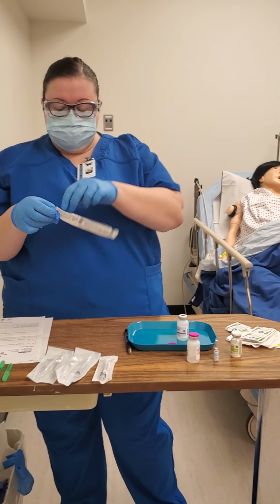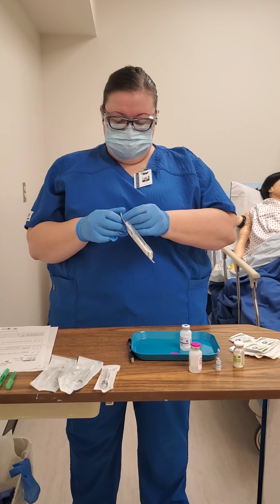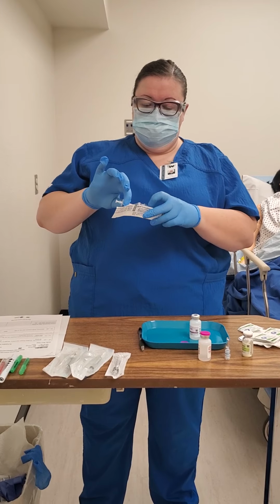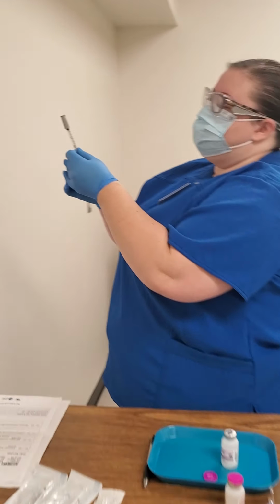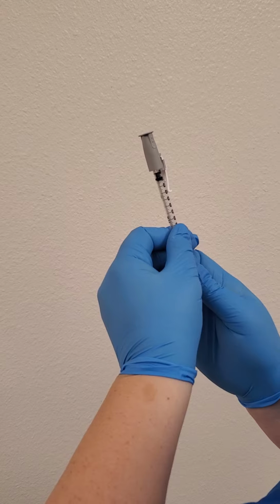I'm going to get my injection needle. Now I'm going to draw up my air here. So I'm going to put 0.1 of air.